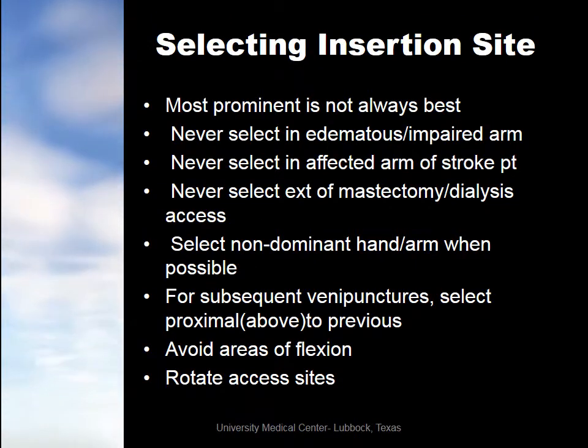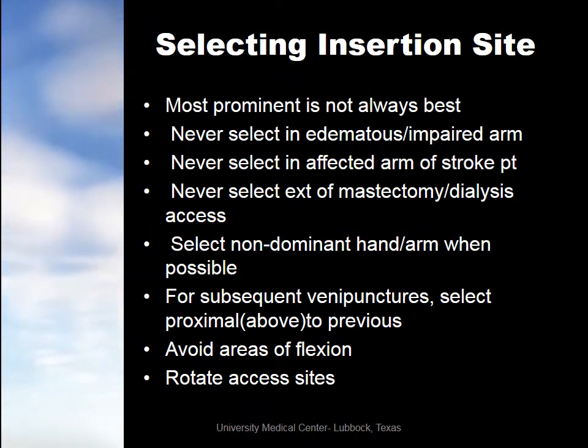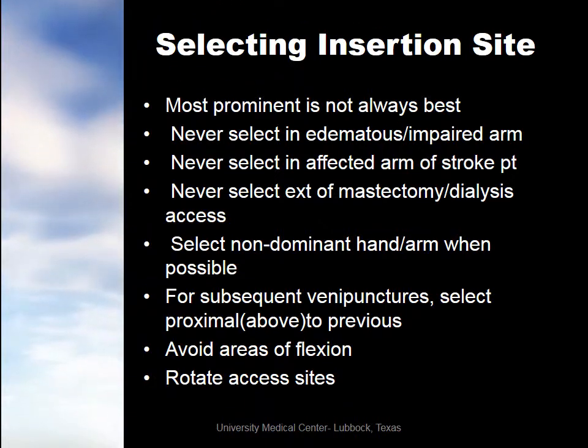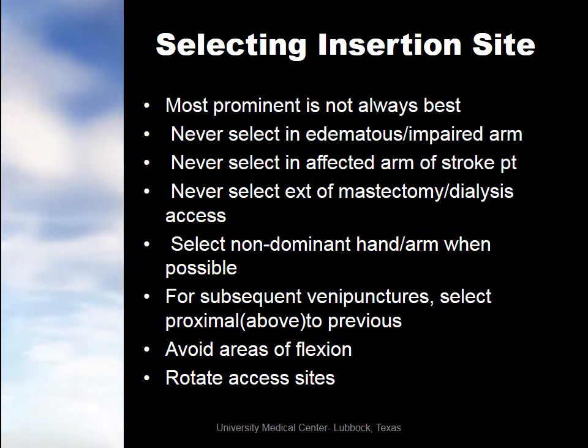In selecting the best site for a venipuncture, remember the VIP: vein, infusion, patient. For the vein, consider its location, condition, and physical path along the extremity. For the infusion, consider the purpose and duration. For the patient, consider the degree of cooperation and compliance and his preference.